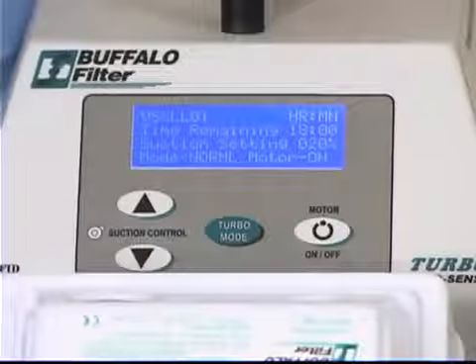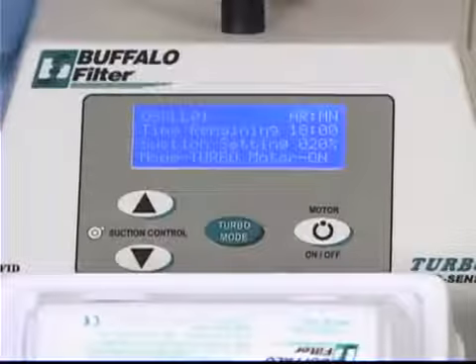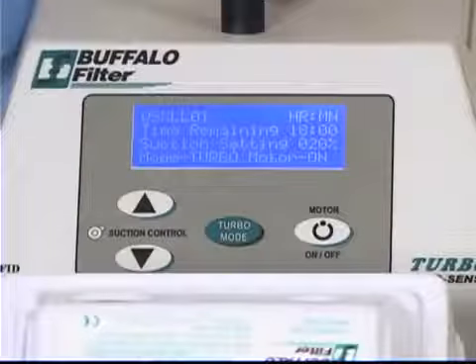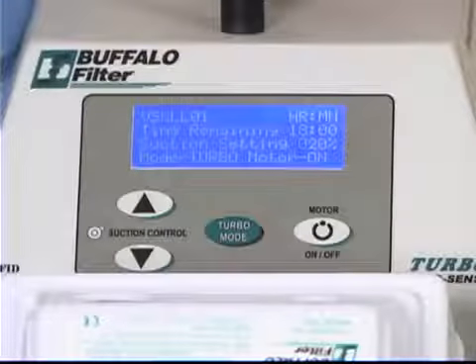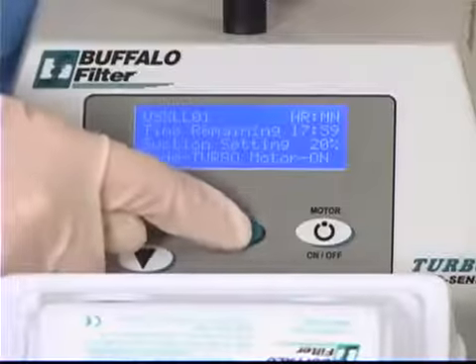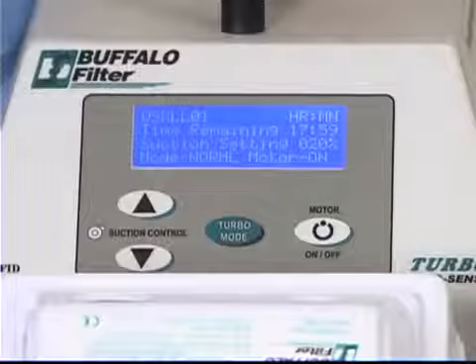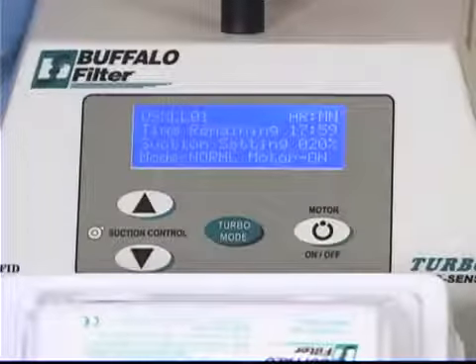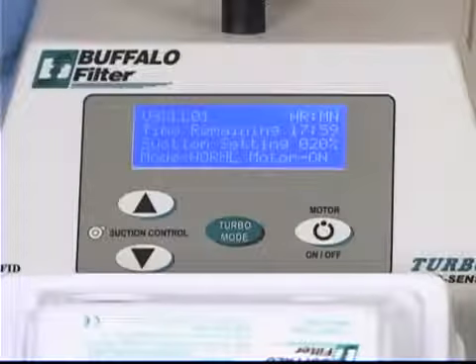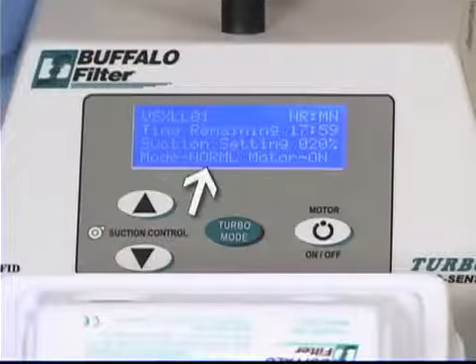During periods of heavy smoke generation, the turbo button may be pressed to capture this high volume of plume. The turbo mode significantly increases the suction power of any given suction level to a point near double the original setting. Once the heavy smoke generation period has subsided, pressing the turbo button again will deactivate this mode and return the unit to whatever suction setting was selected prior to the turbo mode being selected. When in turbo mode, the LCD display will indicate the word turbo and will return to the word normal after this mode is deactivated.